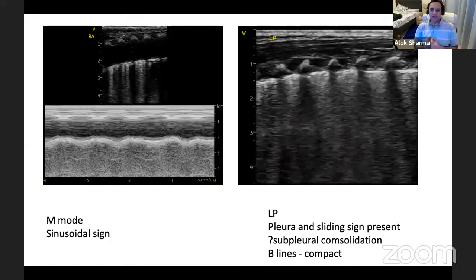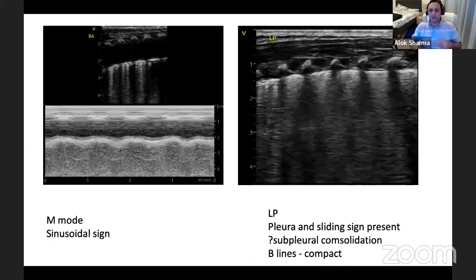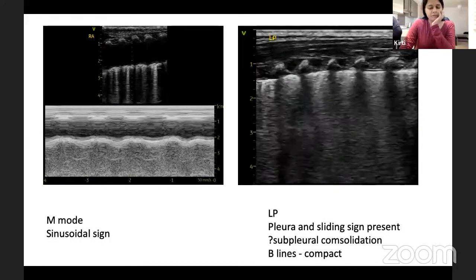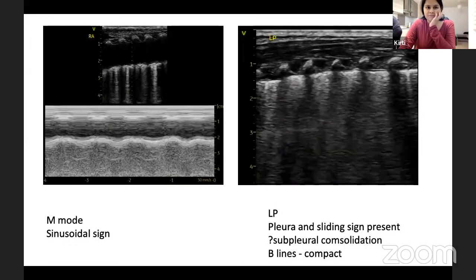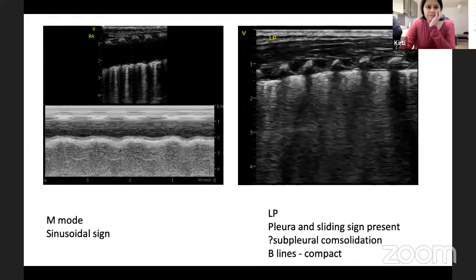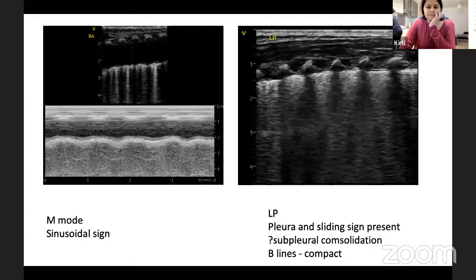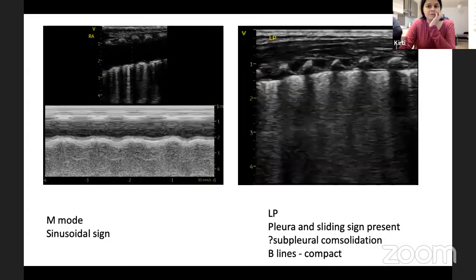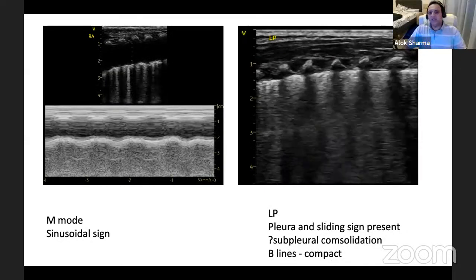When you make an interpretation at this particular point, you're going to clinically correlate. So what's the gestation of your baby? This is a term baby who doesn't have any clinical distress. Yeah. It's basically antenatally diagnosed. So we did an X-ray postnatally. And because there's dysmorphism, he's being worked up for a syndromic cause. But he's okay. Now, this is crucial.